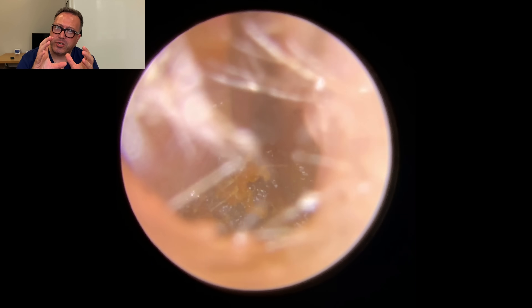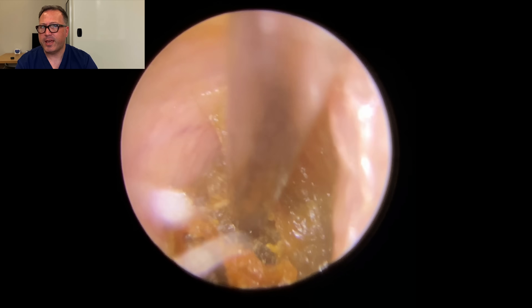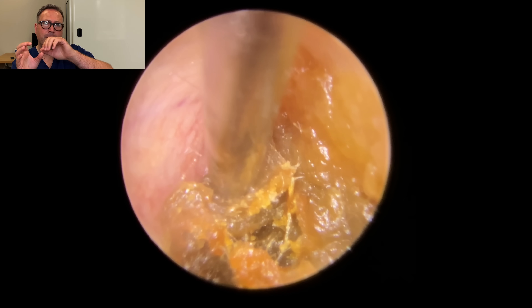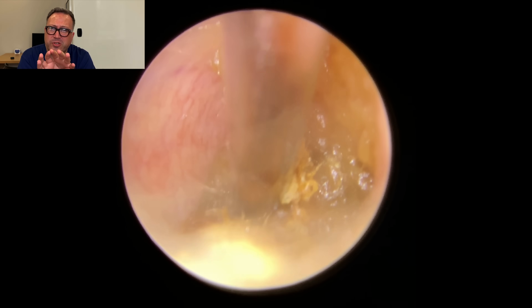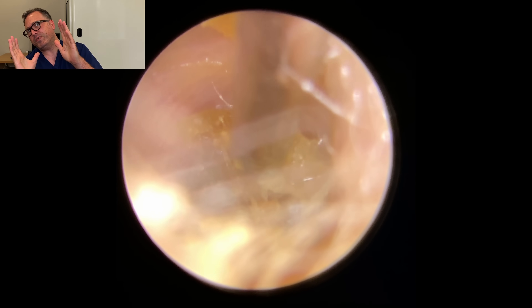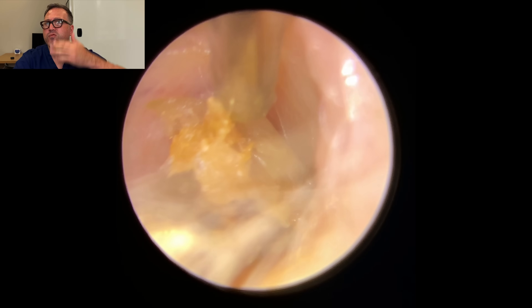You can see now how that whole section is really bound together, really jammed, and it's difficult to get these layers to unpeel from one another. So I've introduced a little bit of olive oil in here, which is just going to help to loosen those layers and soften the skin that's mixed in with this to make it a bit easier to come away. Though you do get, especially with these fine little hairs, the oil can adhere to those little hairs, so as you push the endoscope in it can just blur the screen. This section to the top here is a little bit deeper with an awkward angle — you tend to have to tilt your patient over just slightly. That's a nice long peel going all the way down the canal, which has really loosened this top section.